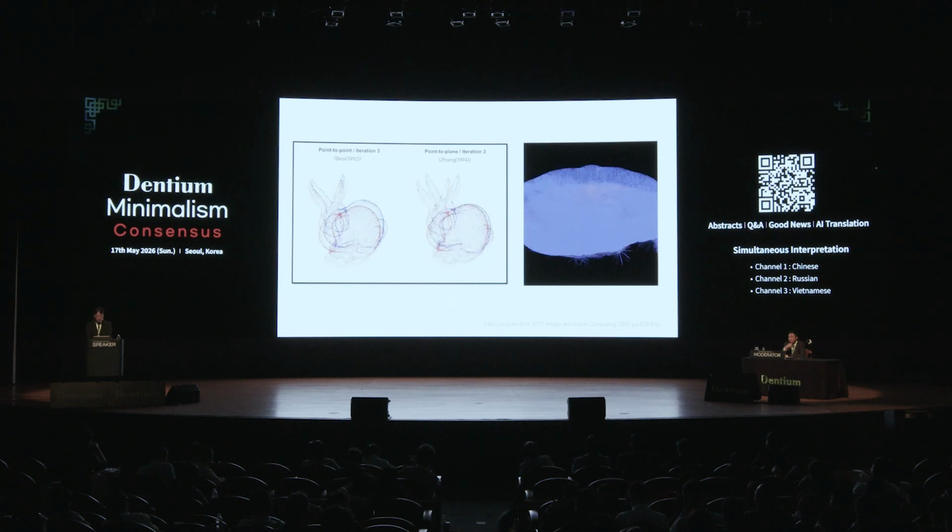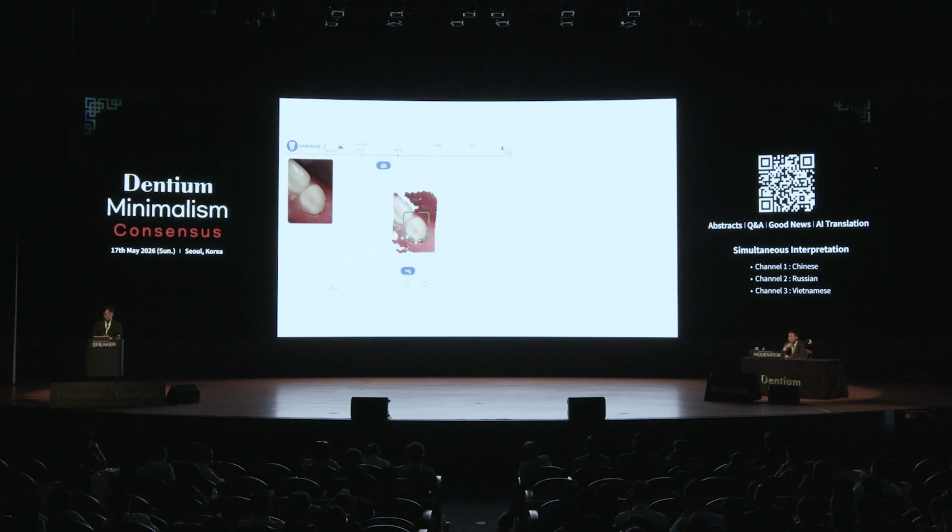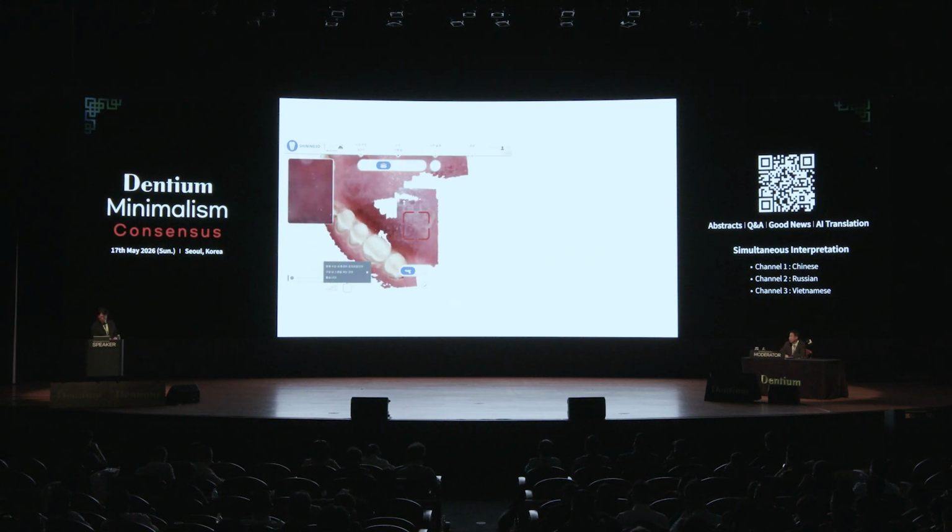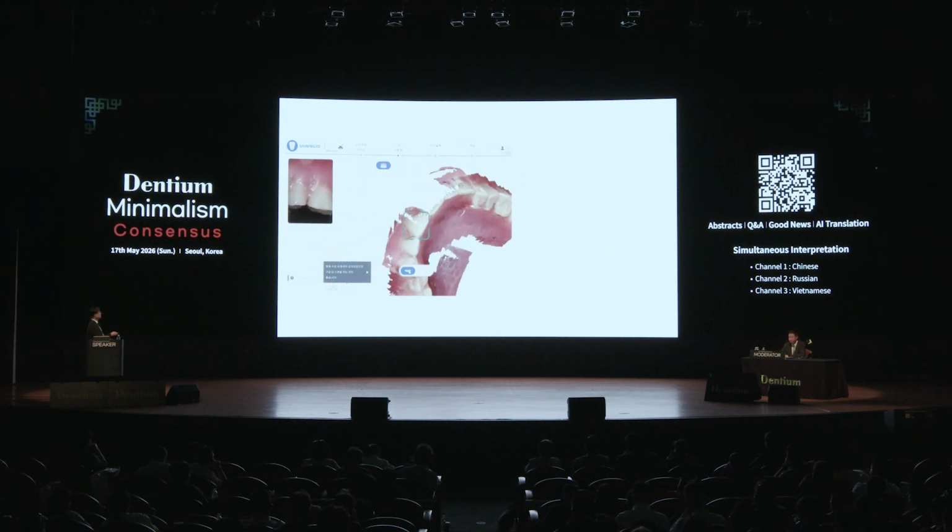Here are the normal directions of the upper jaw. The purple lines show the normal direction. Most of them point in almost the same direction, which means there are few distinctive features, which means drift error can occur relatively easily. So we should be more careful when scanning this kind of area. This is an example of scanning the maxillary denture. During the central palatal scan, you can observe the misalignment of the data here.